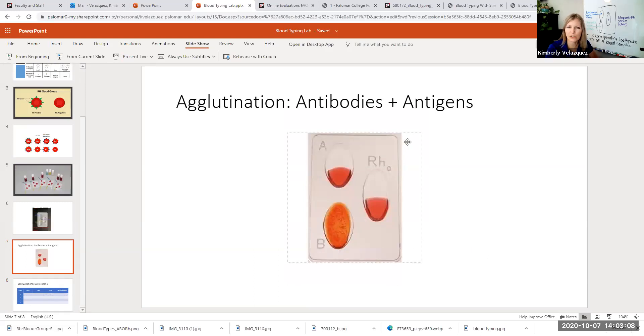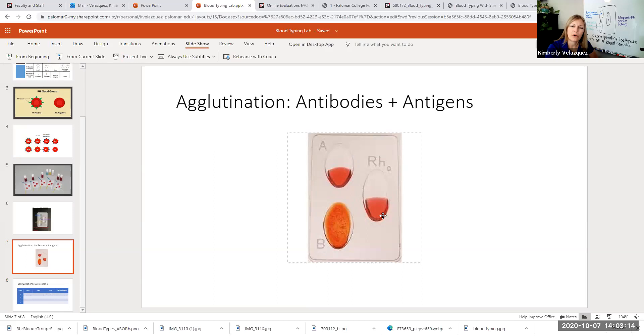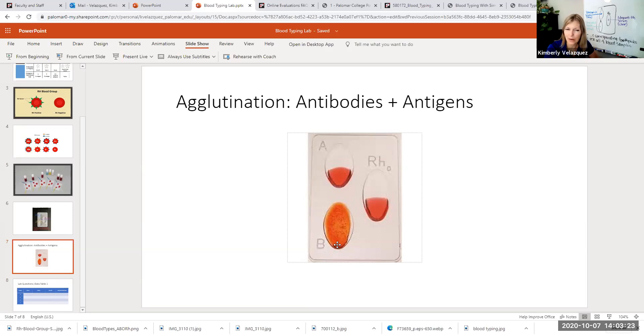So if this was our test that we ran, you can see that there was no clumping in the A or the RH, but there was clumping in the B.